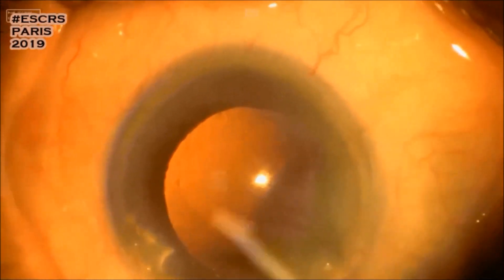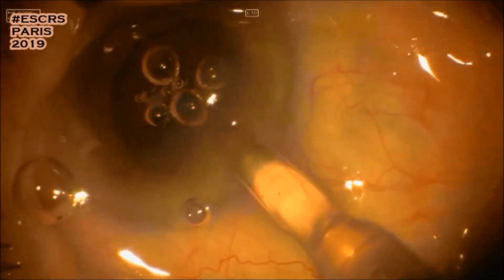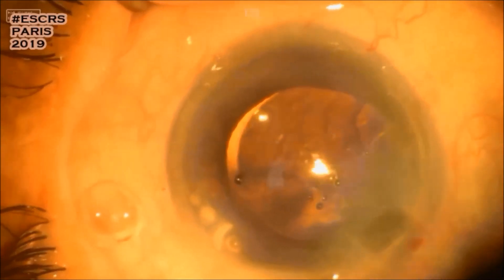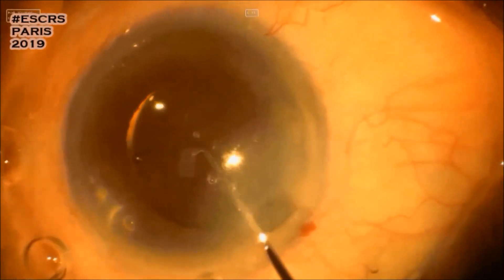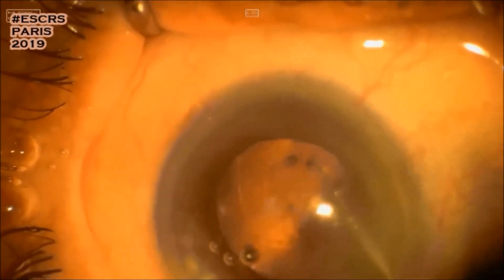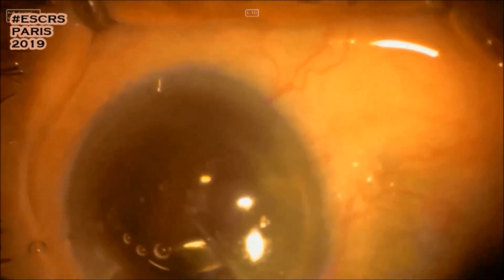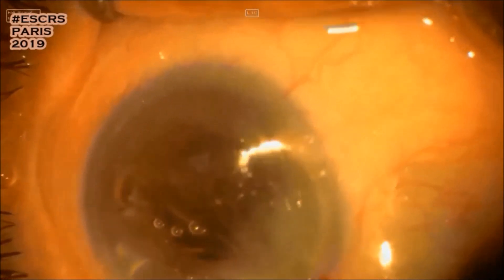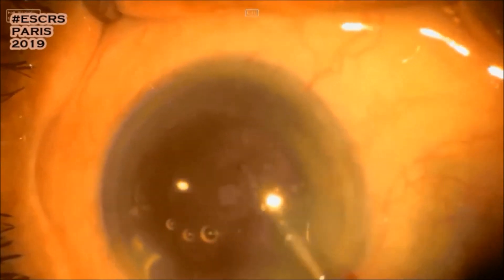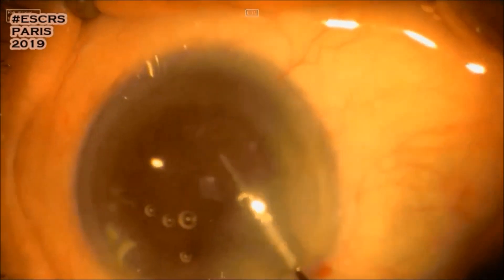Viscoelastic has been injected before delivering the lens into the capsular bag. Oops — the lens is not in the right position. Now the IOL is inside the bag.